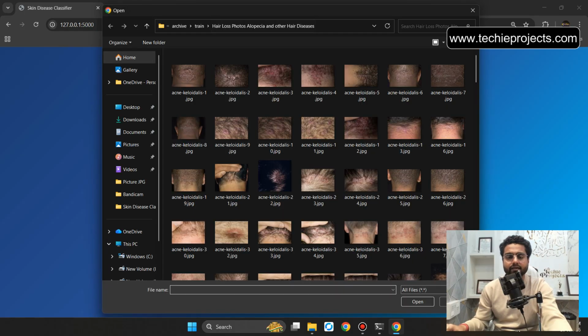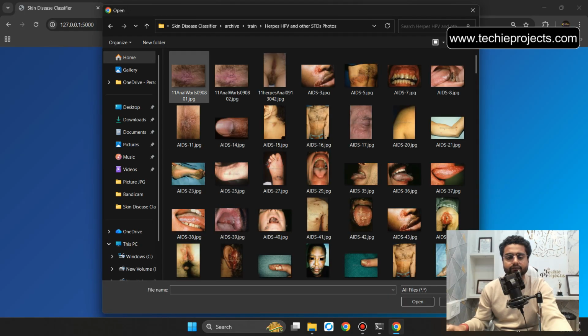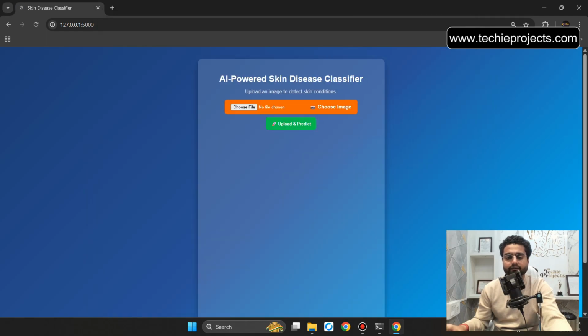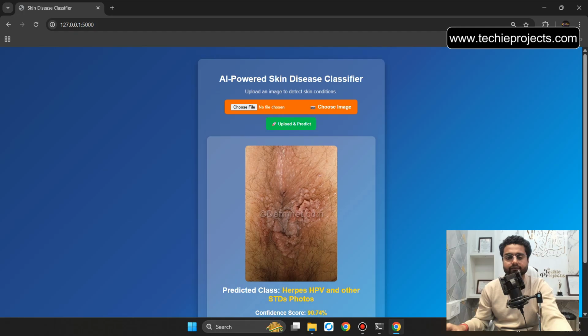So let's select any other image from a different folder. Let's select this folder and select that particular image. Then click on upload and predict. So the predicted class is herpes, HPV, and other STD photos, and the confidence score is 90.74%. Cause: viral infection transmitted through contact. And the precaution: practice safe sex, maintain hygiene, and get vaccinated if possible.